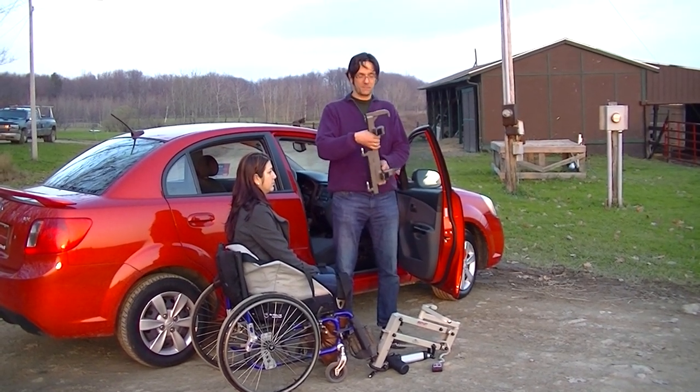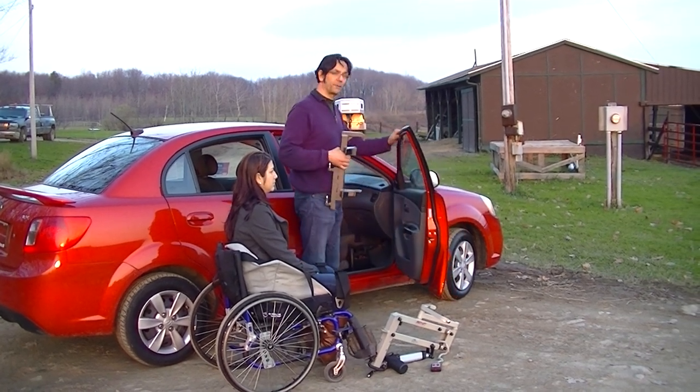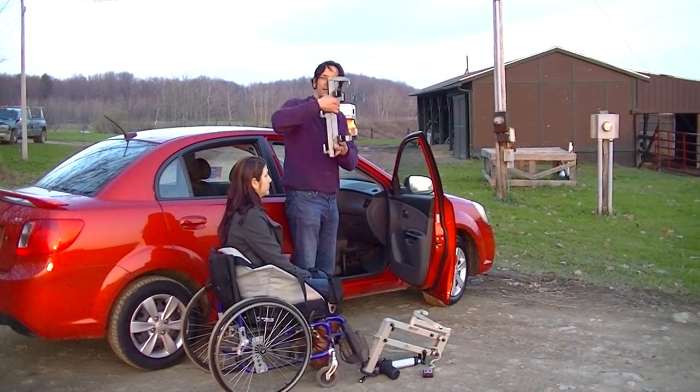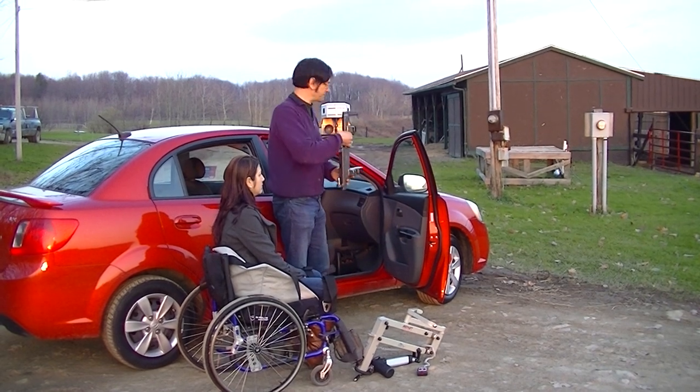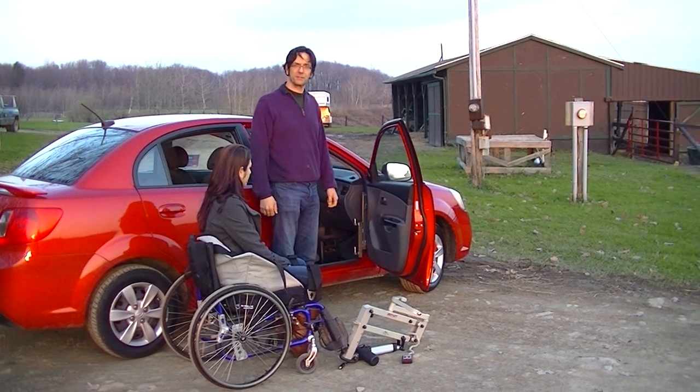Here's the Speedy Bar. It is made specifically for this vehicle. We're going to attach it to the vehicle by opening the door and interlocking this neat little device, called the Speedy Bar, into the hinge. Very simple process — that's the entire installation.